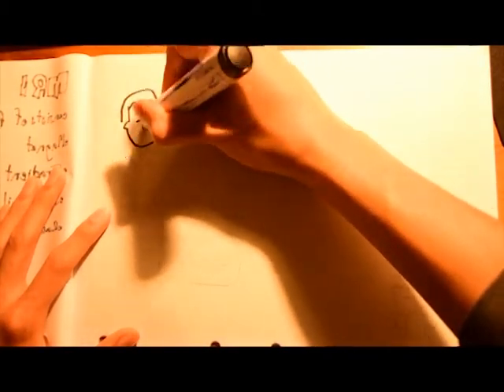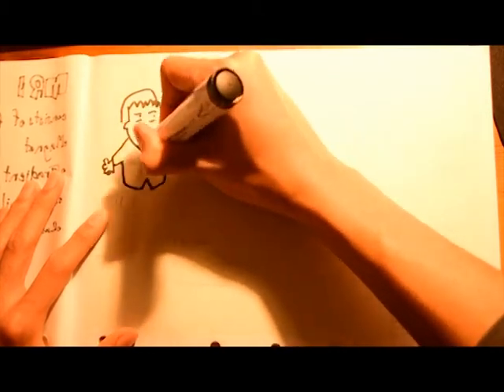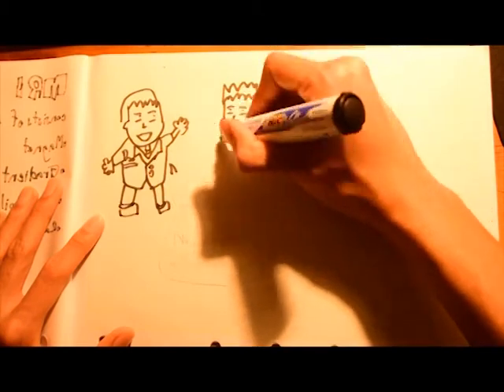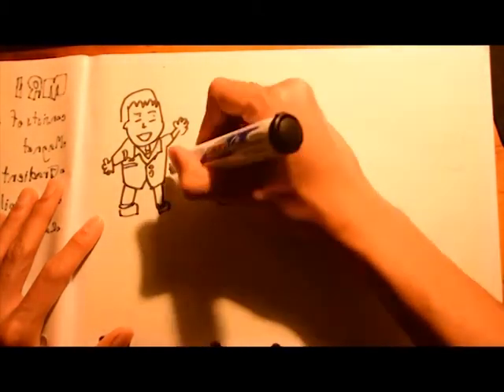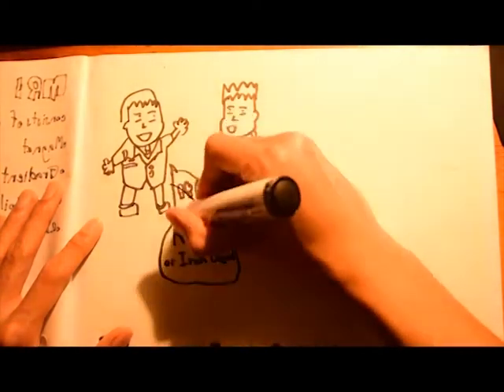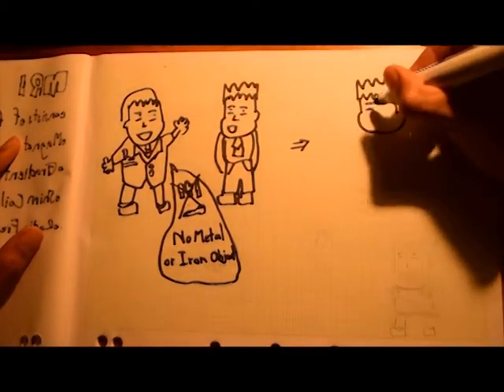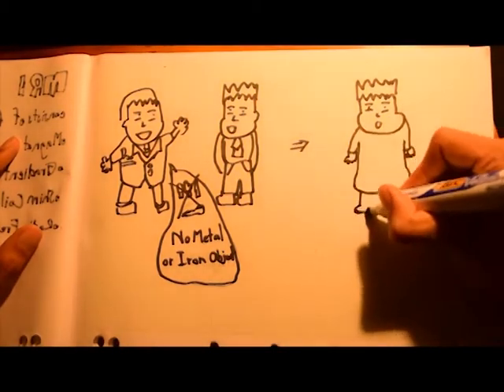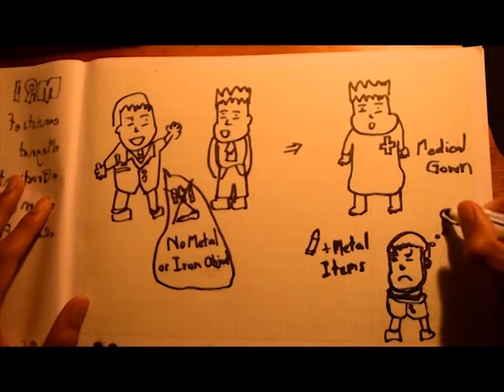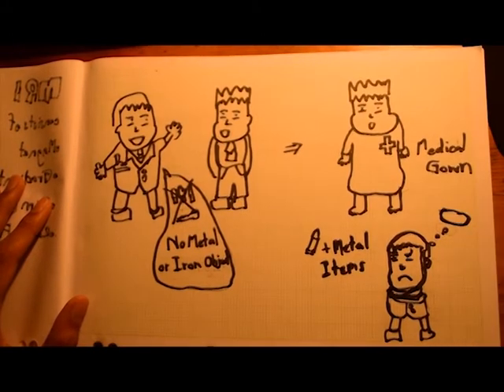In terms of preparing for the MRI scanning, patients will be asked to take metal or iron objects out of their body and wear a medical gown before entering the scanning room. Internal metal objects such as metal clips, medication pumps, or any internal metal items such as shrapnel or metal particles also present a considerable risk and must be made known to the doctor.